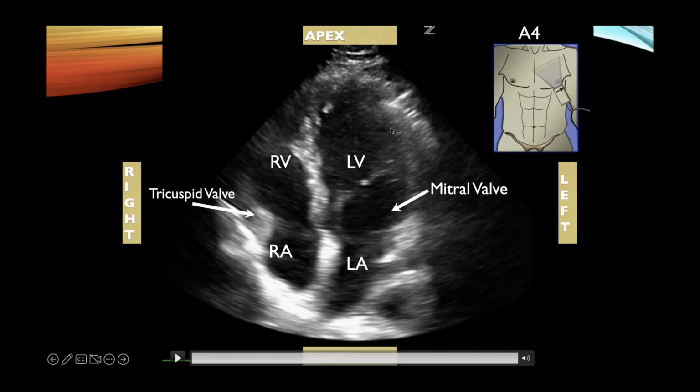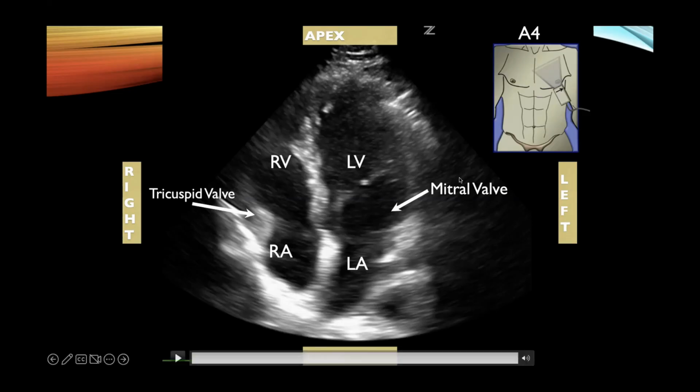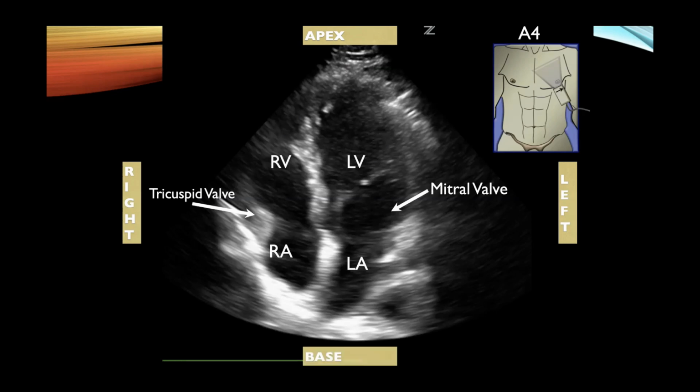So Robert, you are eagerly awaiting a question. I feel it. How big would we expect our right ventricle to be in relation to our left ventricle in this view? In normal circumstance, sorry, there's quite a bit of echo. In normal circumstance, we'd expect it to be definitely smaller than the left ventricle, about half the size. Yeah, so maybe around 2/3-ish, but definitely smaller than the left ventricle, right?